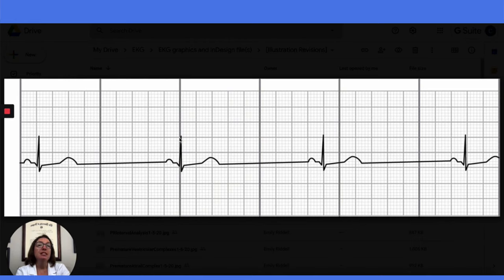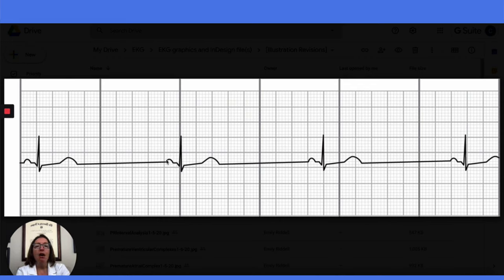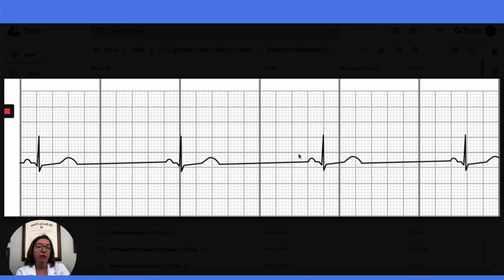So that is definitely on the slow side. If we look at the other components of this EKG strip, we can see that our P-waves are nice and upright, smooth, and consistent in appearance. Our PR interval is of normal duration. Our QRS complex is nice and narrow, and we have a QRS complex for each P-wave across the strip. So it is a sinus rhythm, but because the heart rate is under 60 beats per minute, it is sinus bradycardia.